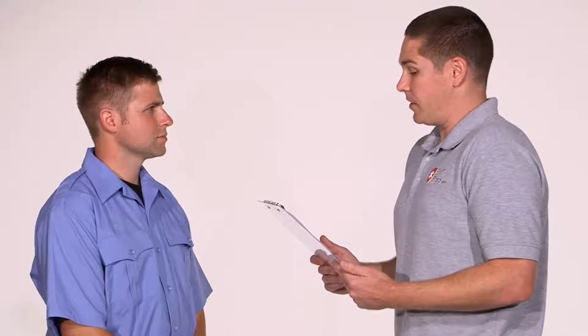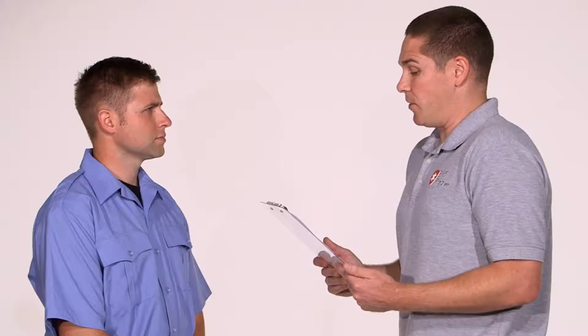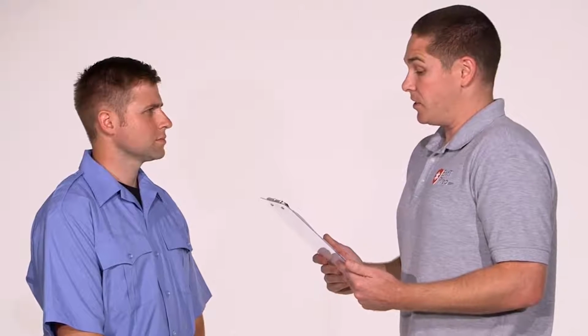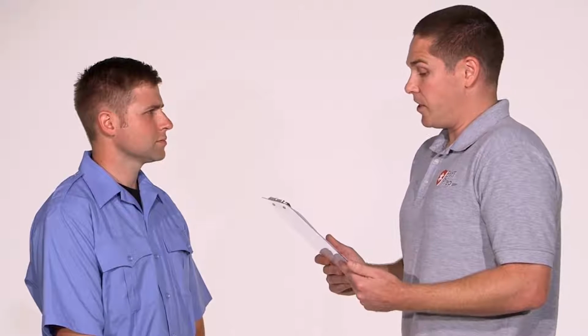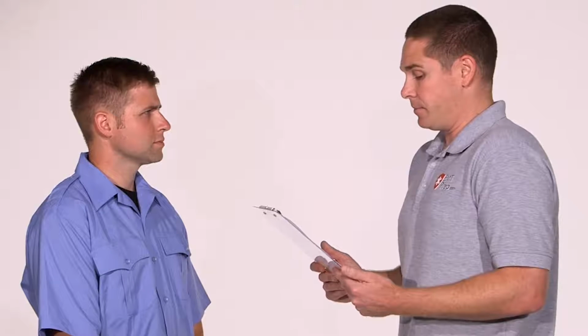Welcome to the Ventilatory Management Supraglottic Airway Device Skill Station. These progressive skills are designed to evaluate your ability to provide immediate and aggressive ventilatory assistance to an apneic adult patient who has no other associated injuries. This is a non-trauma situation, and cervical precautions are not necessary. You are required to demonstrate sequentially all procedures you would perform, from simple maneuvers and adjuncts to placement of a supraglottic airway device of your choosing.